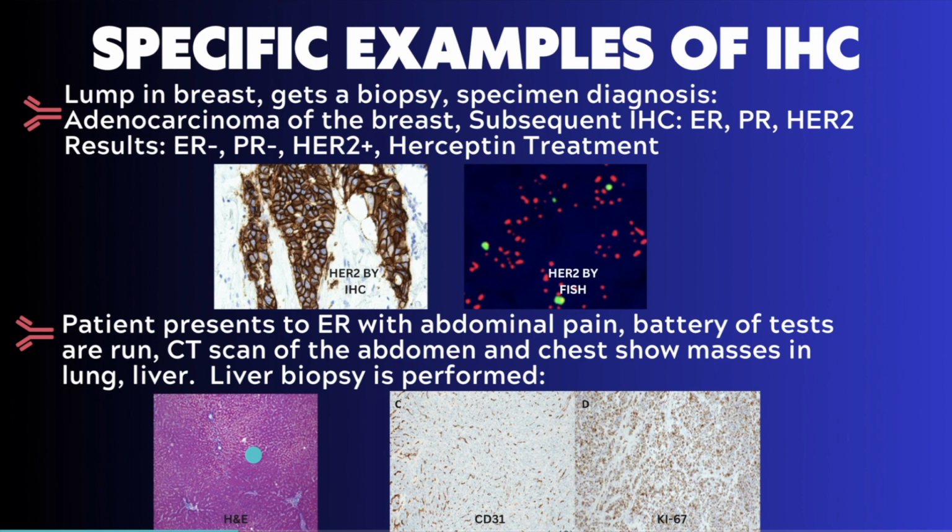The pathologist orders a CD31 and a Ki67 immunostain. The CD31 reveals diffuse vascular activity, and the Ki67 confirms advanced cell proliferation, which indicates a fast-growing tumor. These results, along with the cell morphology from the H&E slide, help the pathologist determine that the patient has small cell lung carcinoma. This type of cancer is almost exclusively associated with patients who smoke.